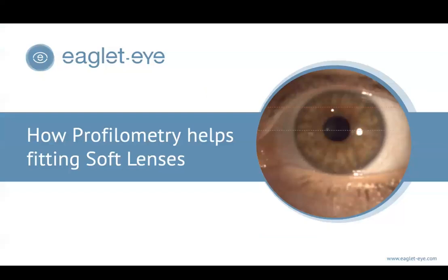Now, the last two profiles we're going to move into, very briefly, I want to show you some cool cases just with soft lenses. Custom soft is something where profilometry is a really cool asset, because when we build custom soft lenses, we're often building or choosing lenses based on the base curve and power. The reality is that if you have the insight and ability to look at the sagittal height of the eye, that can also be largely responsible for success in comfort and fit when it comes to fitting soft contact lenses.